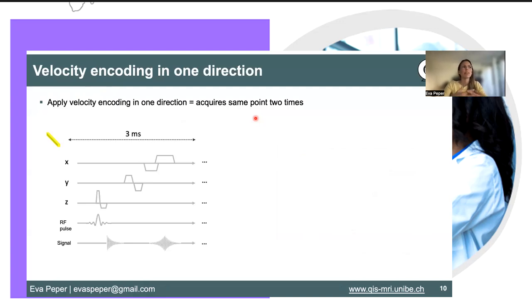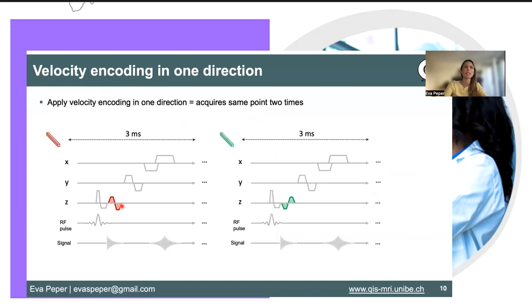If we now want to make this a flow MRI image, we take this basic 3D sequence part and add another gradient, which is the flow encoding gradient. And we repeat the scan, but now with the inverse gradient of the one that we acquired.